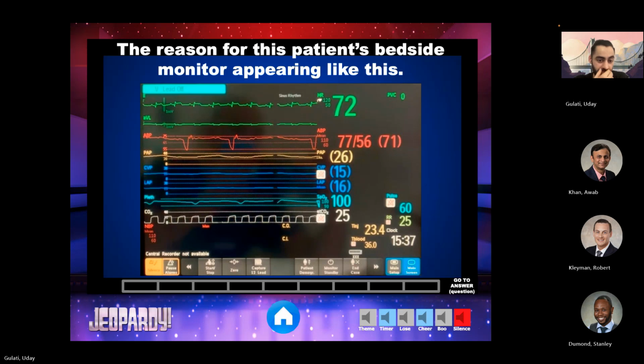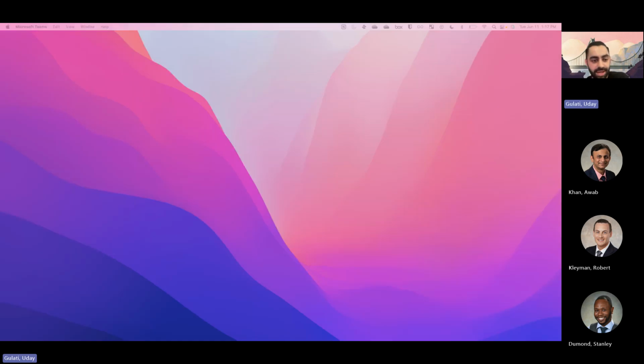The important thing here is don't do CPR on this patient just because all their lines are flat. The nurse is going to be like, wait, do they have a pulse? And then they don't, because they're not able to immediately detect it. You obviously don't want to start CPR on this patient. Solid job, guys. Hope you had fun.